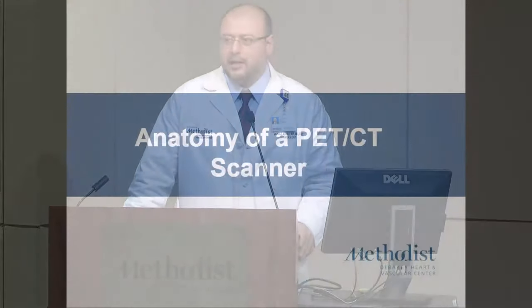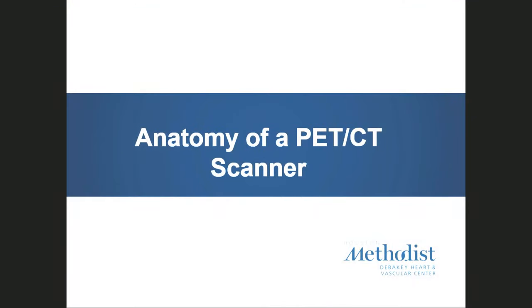Okay, so what's cardiac PET? What does PET stand for? Positron emission tomography. So how is it different from SPECT? SPECT is the modality that we use all the time to image patients. That's the most commonly used modality in the United States to assess patients for ischemia or for coronary artery disease. So how is it different machine-wise?